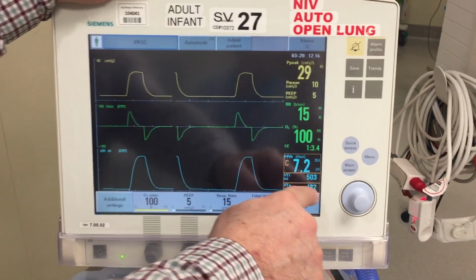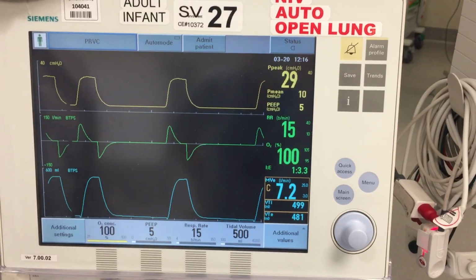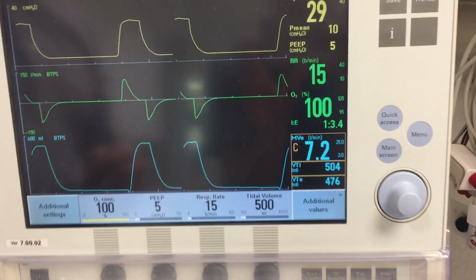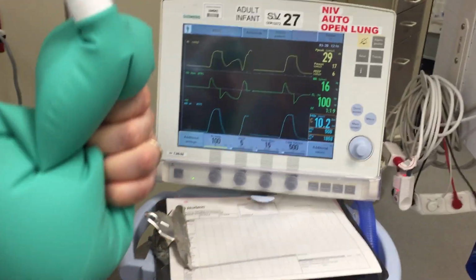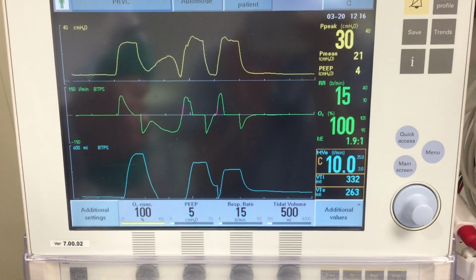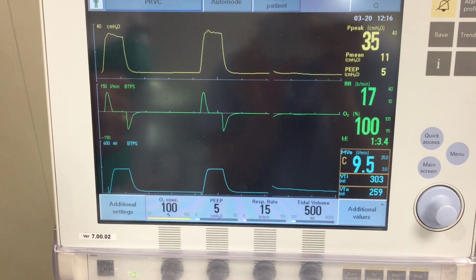And if we look at our expiratory tidal volumes, in this patient data section, we can notice that the tidal volumes are in the 500 range. So everything is going well. Okay, so if I were to, for example, reduce the lung compliance of the patient right at this moment by just simulating that, we'll get some alarms, and you can see the tidal volume drastically change. So what's happening now is the pressure, the PIP, is stepping up to try to achieve that tidal volume.